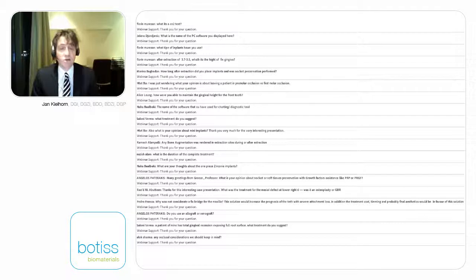Yes, if you use allograft bone and you put it in PRF fluid, you get a sort of sticky bone that you can put in, and then you have a sort of fibrin blood clot, and you don't have to use a membrane. I will still use PRF on top of it just to have the best soft tissue wound closure and healing. That's why I use it.